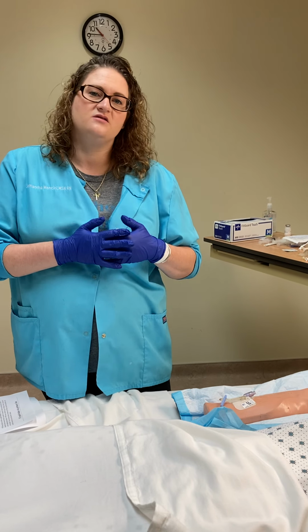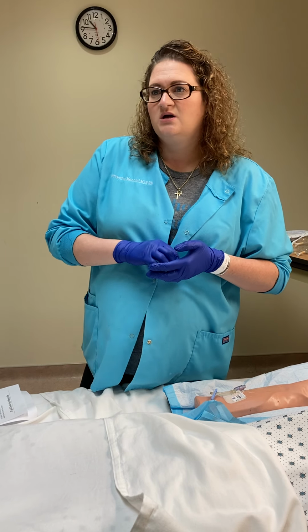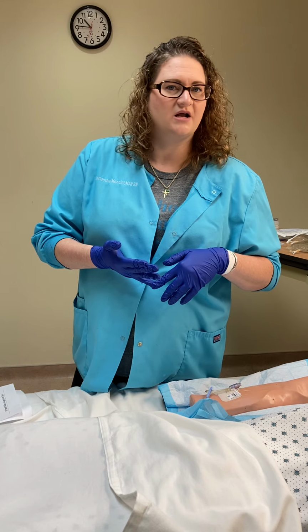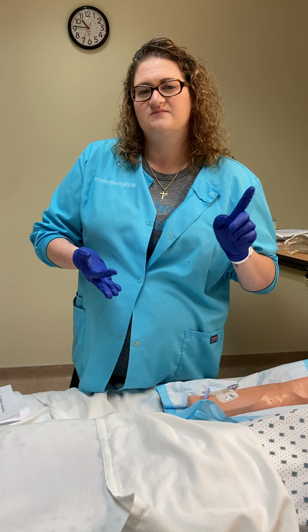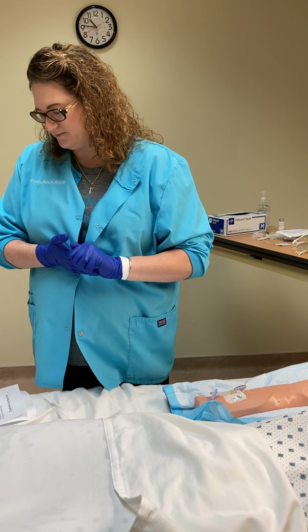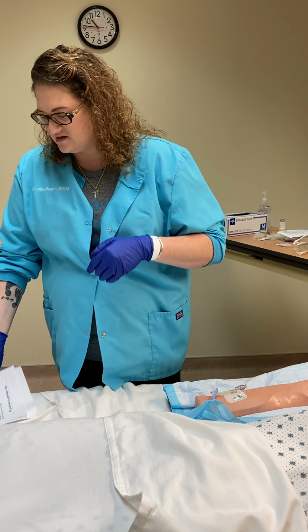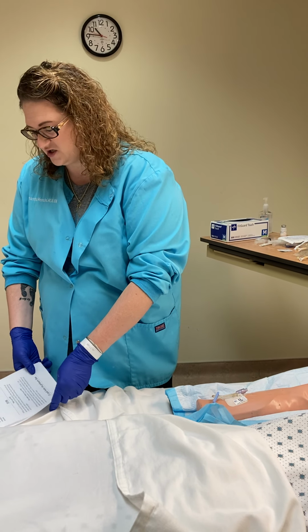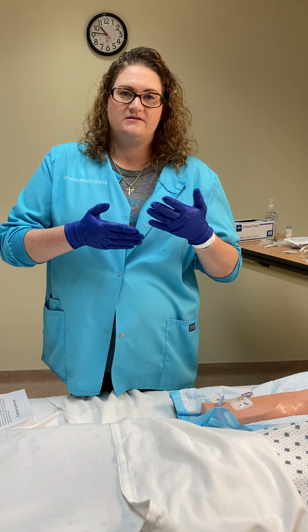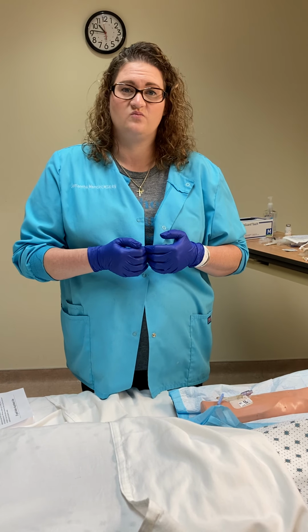You'll most likely see those and be able to administer those in the clinical setting as you go through the program. Colloids are the other type of solutions, and those are usually your blood products: red blood cells, plasma, platelets, and albumin. You'll probably get the opportunity to watch those, and that's going to help increase the blood volume that you have. They are much more viscous, and there's usually a lot more in the process, as far as maybe needing a second nurse to double check you to be able to give those products.